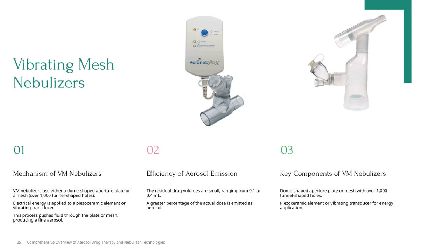Let's look at the efficiency of aerosol emission. The residual drug volumes in nebulizers are quite small, typically between 0.1 and 0.4 milliliters. This means that a larger percentage of the actual dose is effectively emitted as aerosol, making the therapy more efficient.